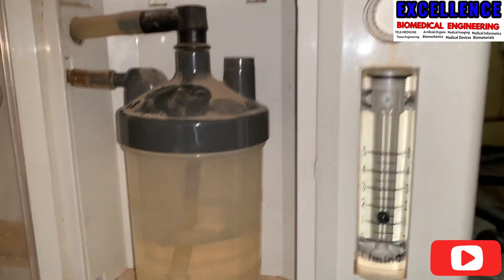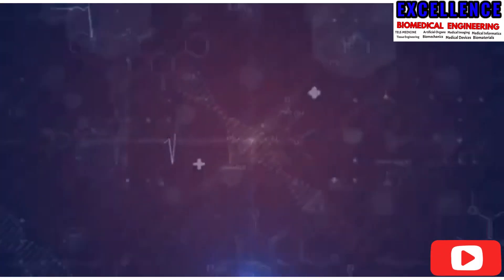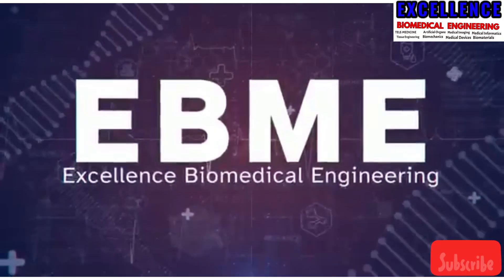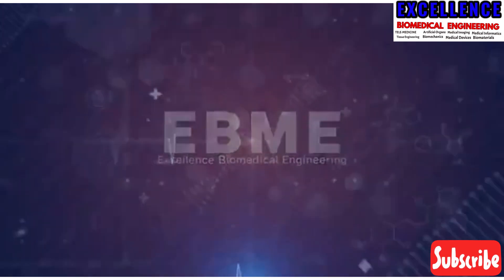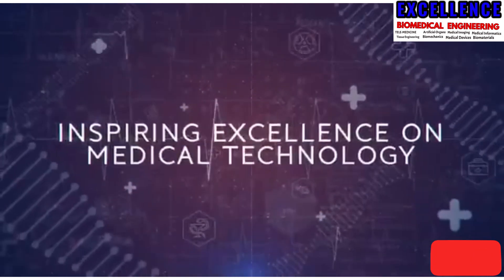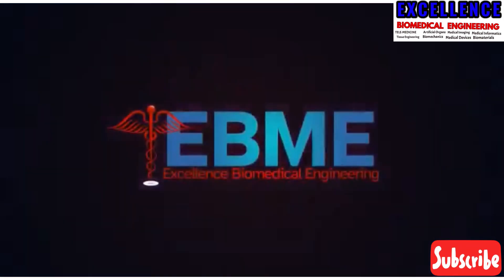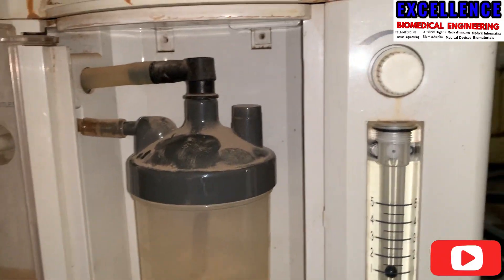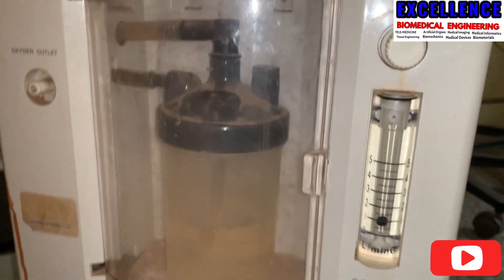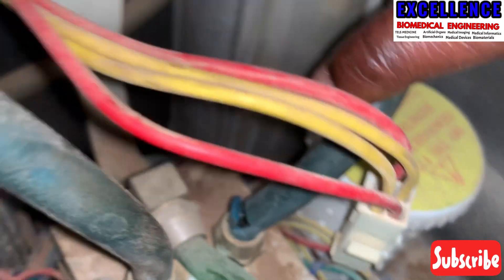It is actually not a big deal. The only thing we have to do is check the tubing — that is, the connection from the oxygen tank to the flow meter. That is where we could trace the main problem.